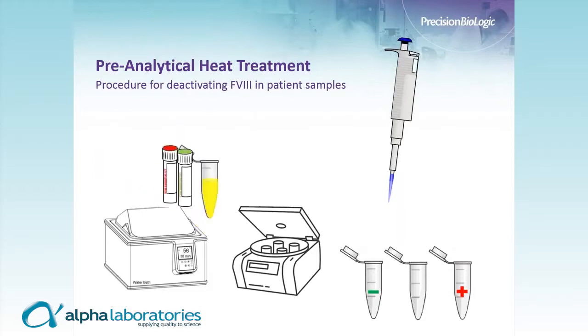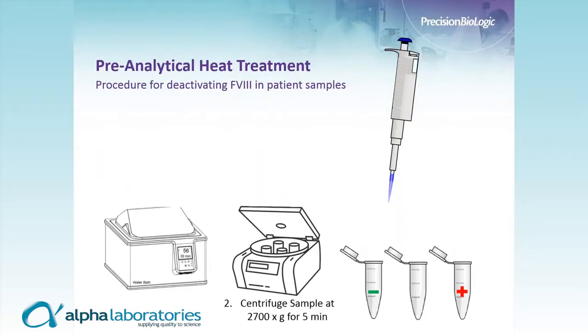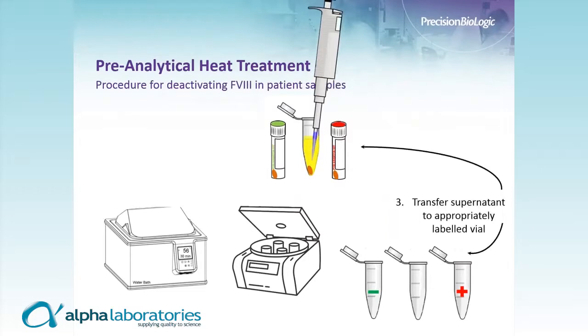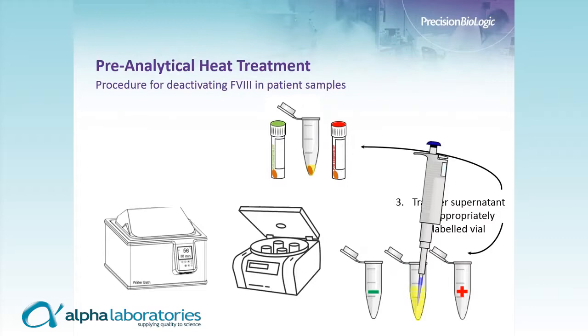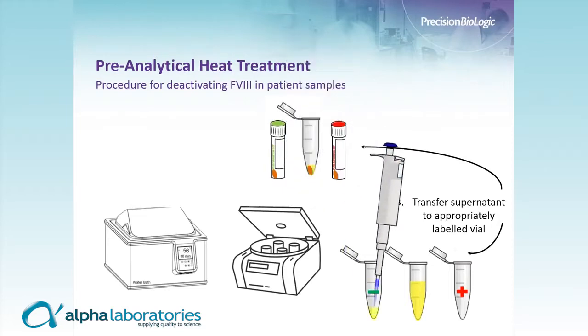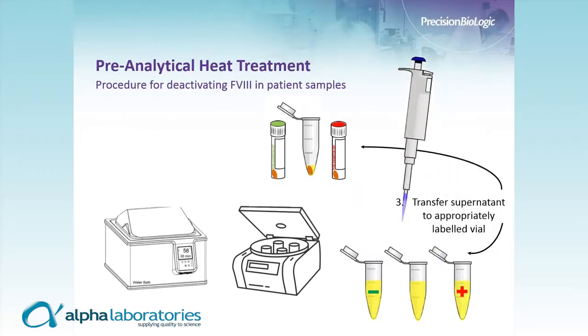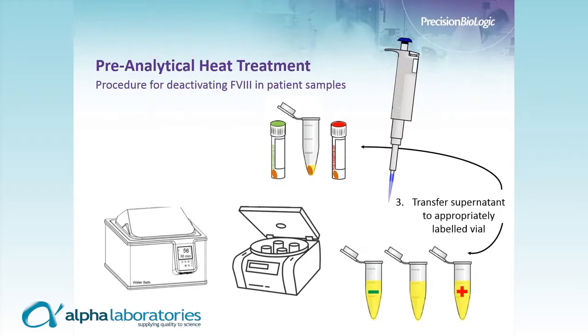Following that 30-minute heat inactivation, the samples are moved to a centrifuge and spun down for five minutes. After centrifugation, you will see that a pellet has formed at the bottom of the vials — this is the denatured Factor VIII. We then transfer the supernatant into appropriately labeled vials for the remainder of the Bethesda assay, being sure not to disturb the pellet, doing this for the patient sample, negative control, and positive control.